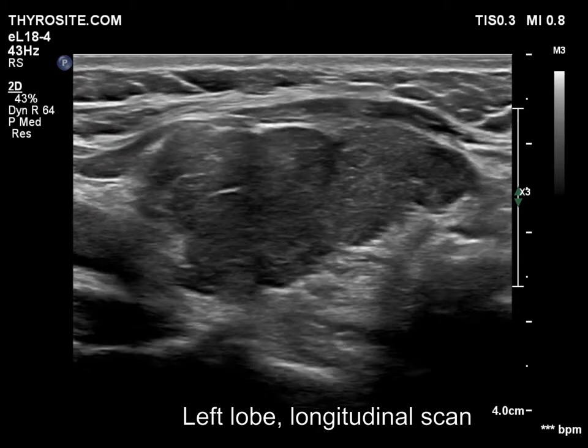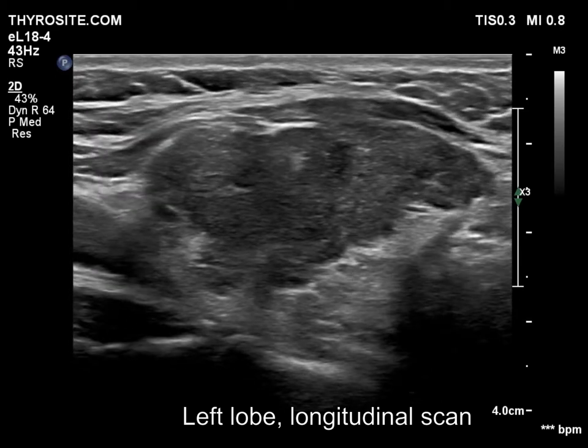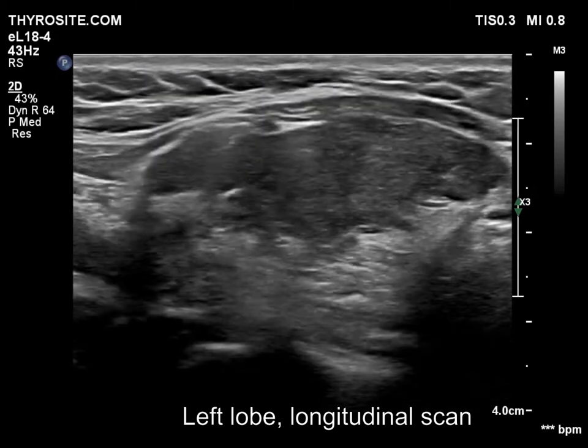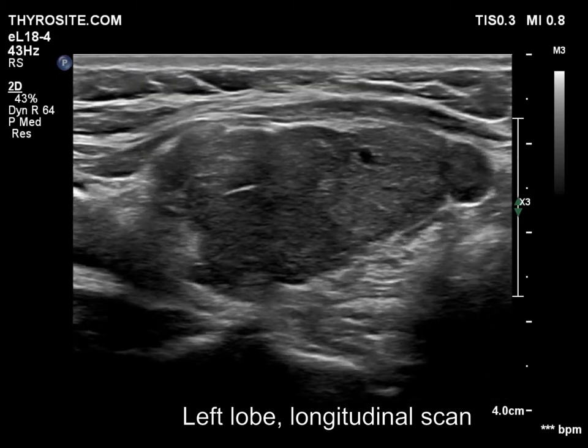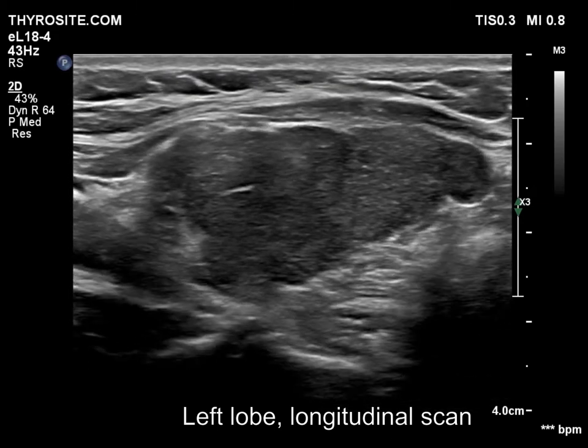Note the irregular lobulated margins of the central hypoechogenic part. It is essential not to mistake this pattern for a large hypoechogenic nodule.